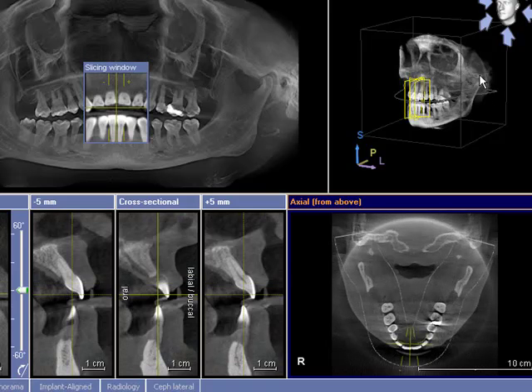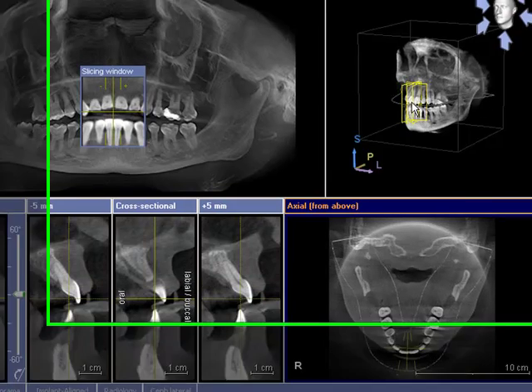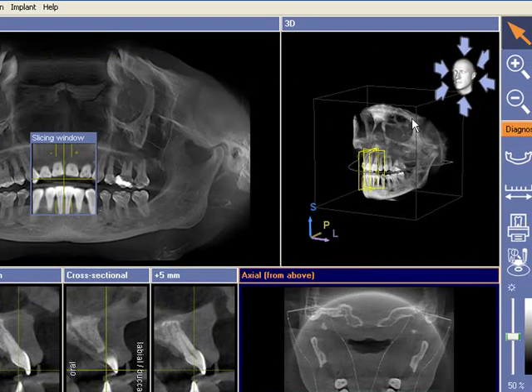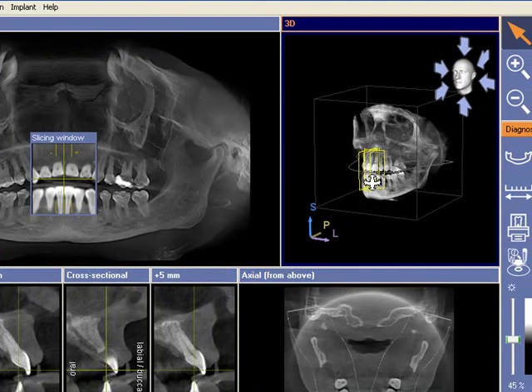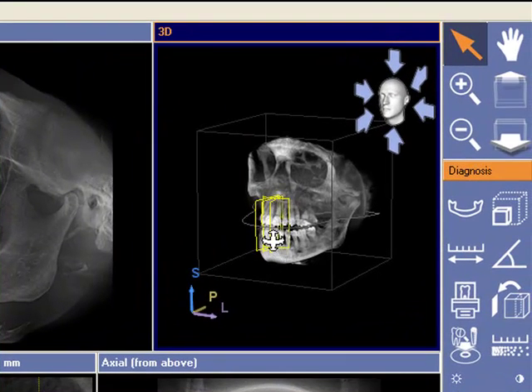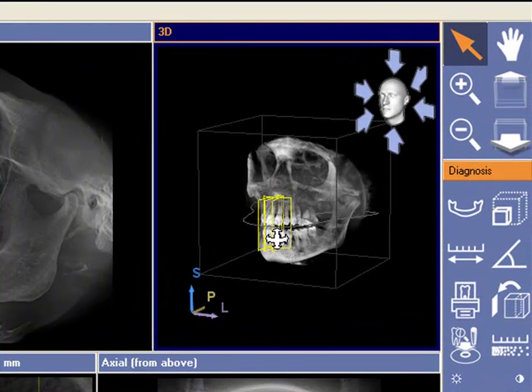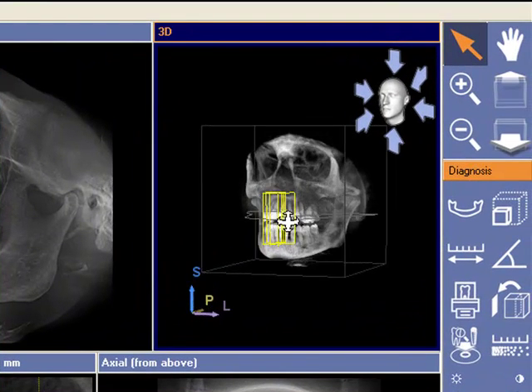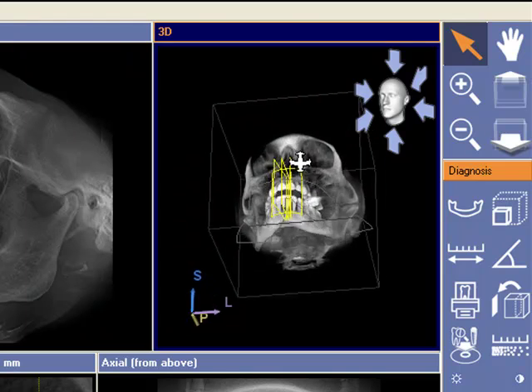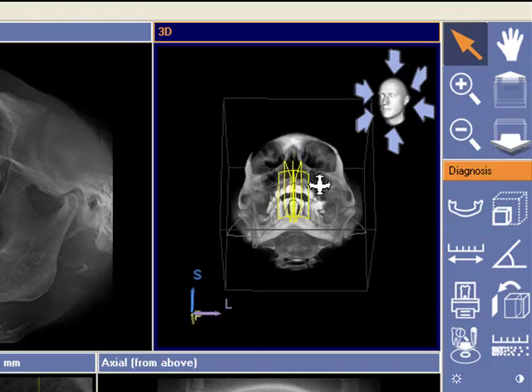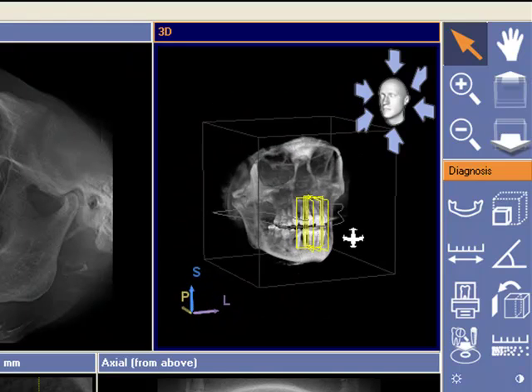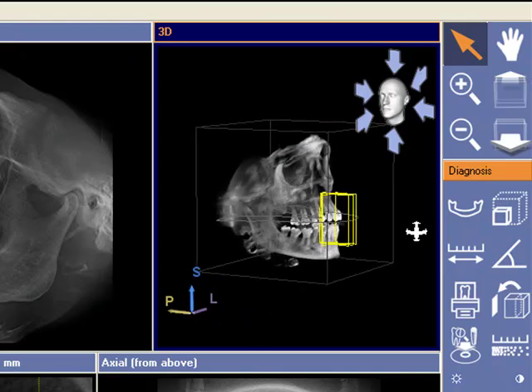With your 3D image you won't be able to scroll through the volume, but you will be able to manipulate that skull. So left mouse click and hold — you'll see the four rotating arrowheads — and just move it to whichever position.